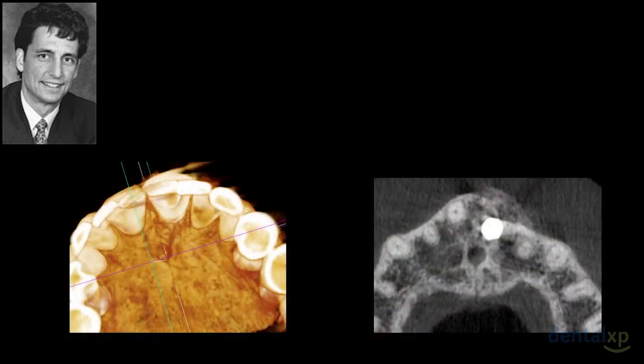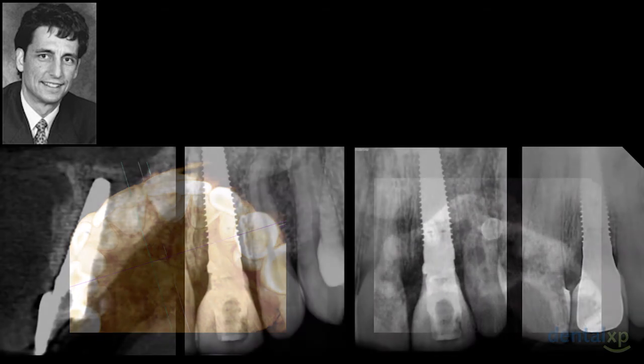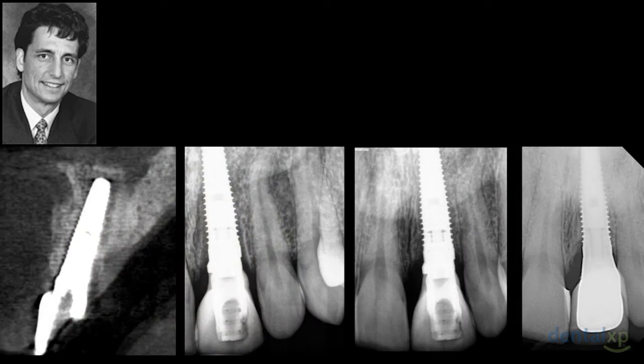And you can see our CBCT to analyze what we've accomplished, make sure that we've stayed away from all of the key anatomy, and we can make sure that we've got what appears to be excellent buccal bone, because this bone level is critical if we're going to move on to the restorative phase. So we'll go ahead and measure that and make sure we have that 2 millimeters prior to sending them off for restoration. There are going to be a few cases where you don't get that, but if it's only 1 in 20, I think moving forward with an immediate is a reasonable outcome, especially in patients that are going to be very demanding. So if there's insufficient buccal bone, then you have to make decisions.